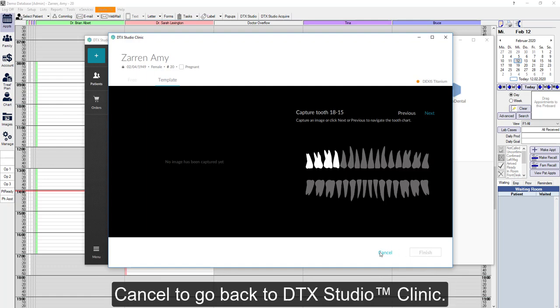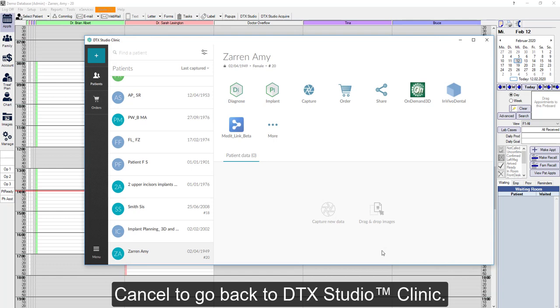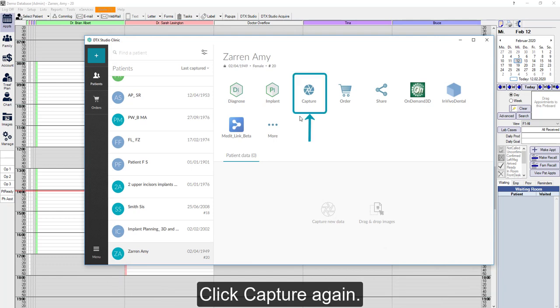We will cancel for now to go back to DTX Studio Clinic. To reopen the capture model, click Capture.